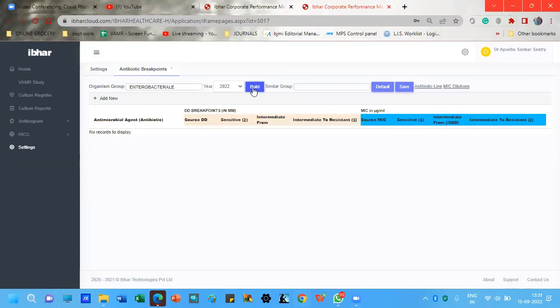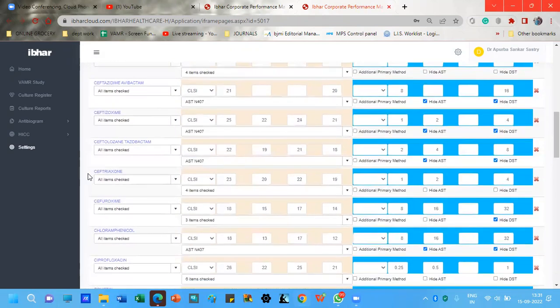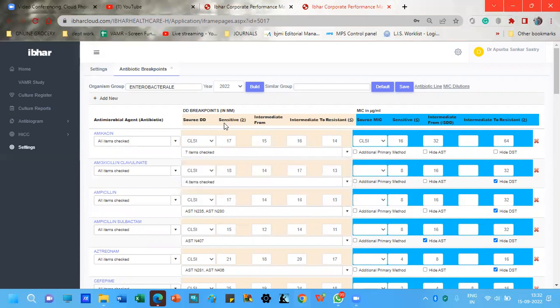So these are the various antibiotics with test. Okay, so amikacin, amoxiclav, these are the antibiotics, but with test we have what the antibiotic is used for, what specimens it needs to be reported for, then what are the various susceptibility panels or Vitek cards for which these antibiotics should appear, the various breakpoints for the disk diffusion as well as the MIC, and what is the source.